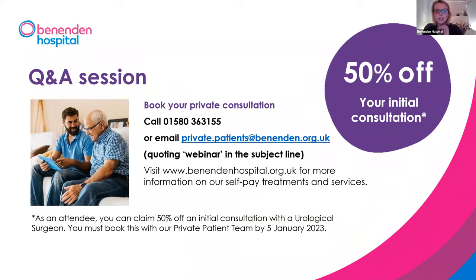Christopher says that one slide mentioned a catheter free after 1 month. Can you expand on this, and how long are you in hospital? So that slide was referring to people in one study who had the Urolift when they already had a catheter in. So that's a slightly different scenario. Most people who we do Urolift on do not have a catheter in before or after the procedure. We don't routinely put a catheter in. This is a day case procedure, so people come in and go home the same day. There's no need to stay in hospital.